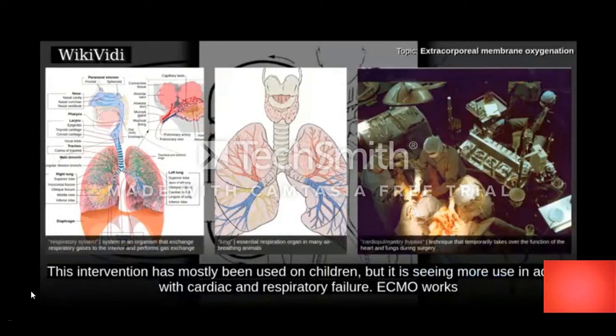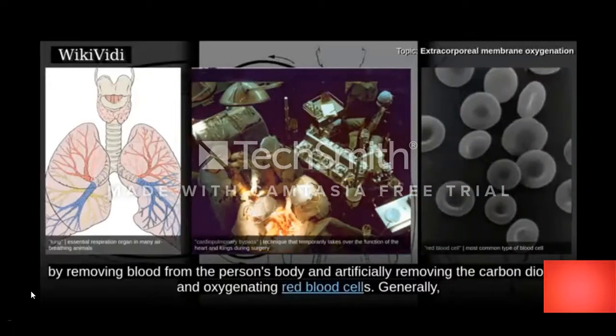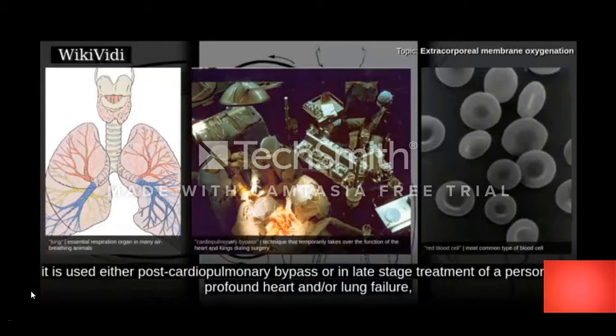This intervention has mostly been used on children, but it is seeing more use in adults with cardiac and respiratory failure. ECMO works by removing blood from the person's body and artificially removing the carbon dioxide and oxygenating red blood cells. Generally, it is used either post-cardiopulmonary bypass or in late-stage treatment of a person with profound heart and or lung failure.